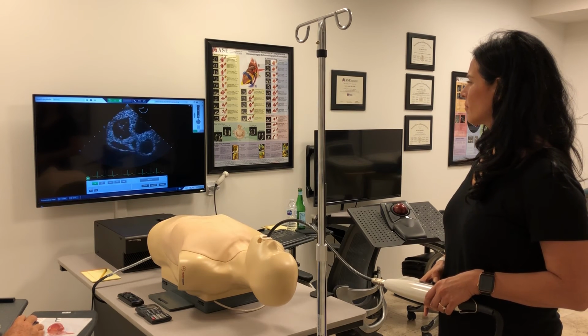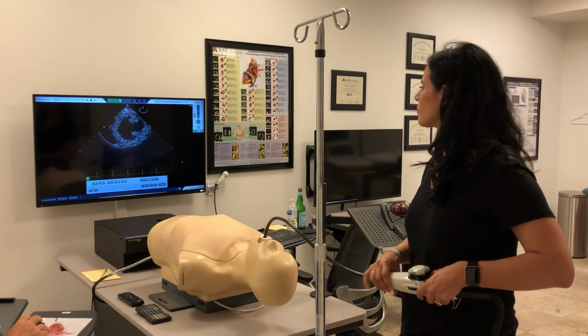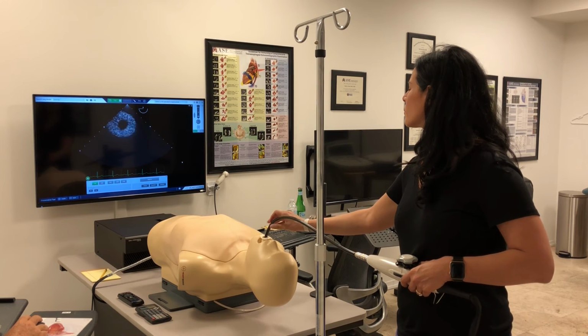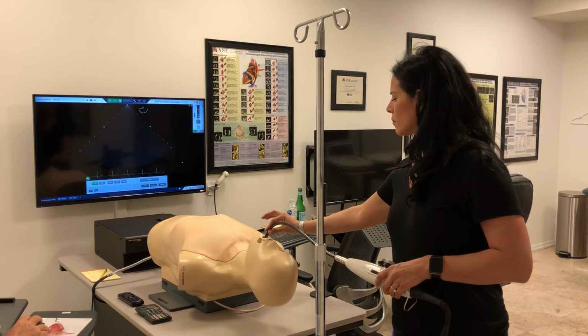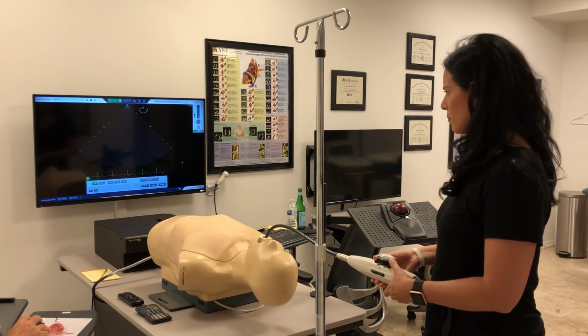Good. Let's skip on here to the deep transgastric view. So let's go back to the mid-papillary view, center of the left ventricle, and let's push the probe in until we don't see any more of the left ventricular cavity, until the cavity abolishes. And then let's push a little bit further until the myocardium completely goes away. Then let's back off the probe 3 centimeters and push our fingers towards the bite block.